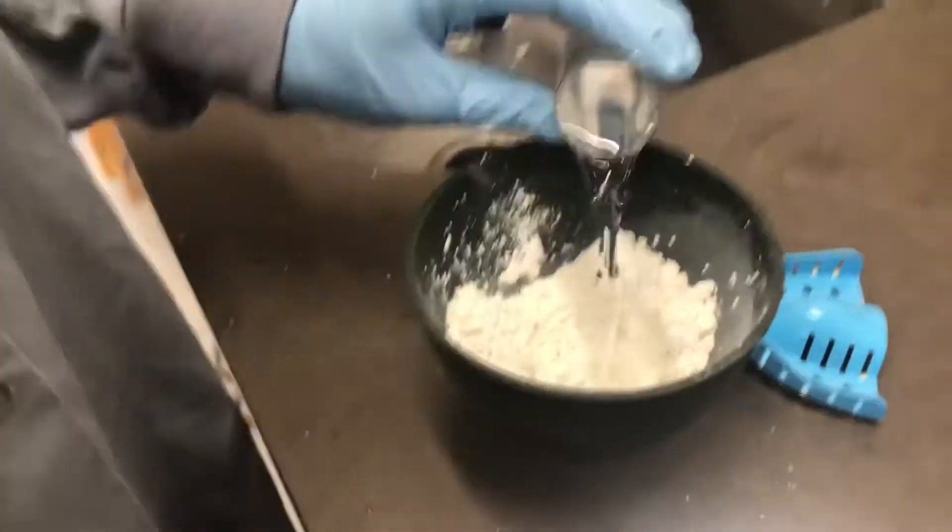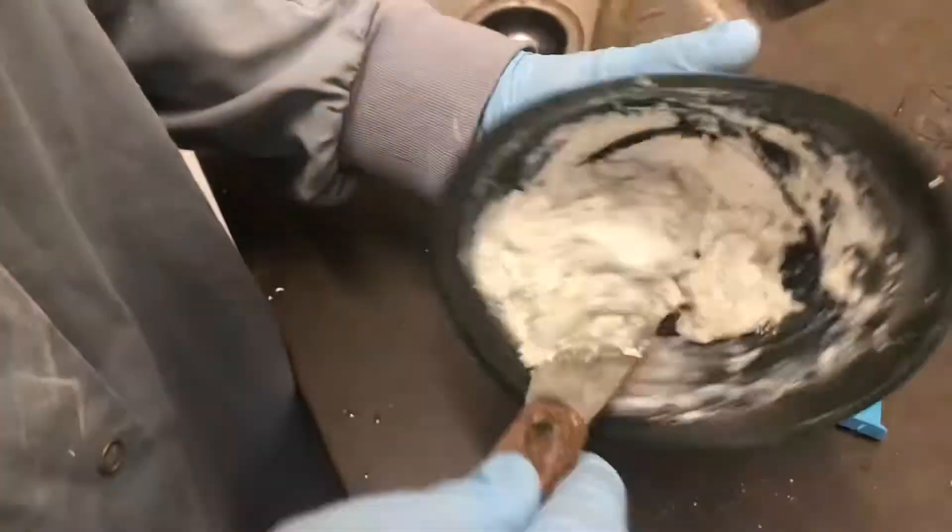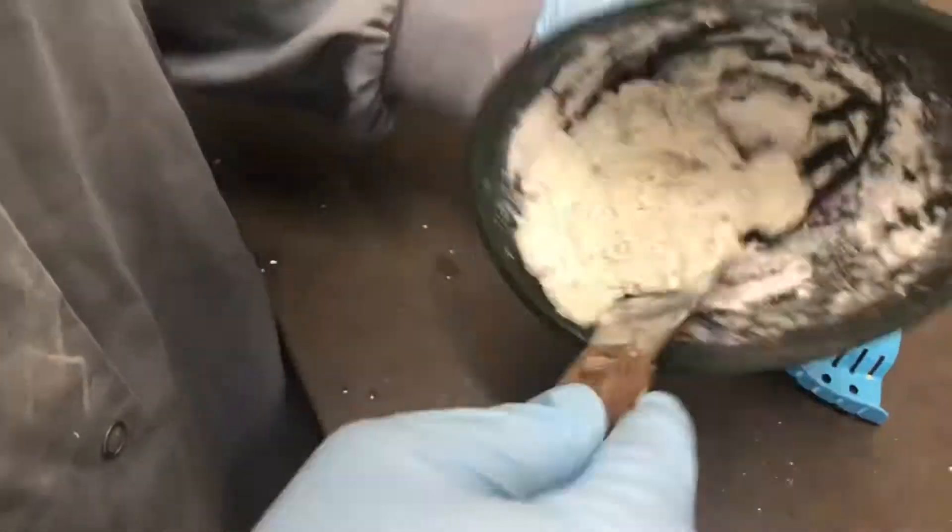After this, you want to be ready to mix it. Then you want to fill up your tray.